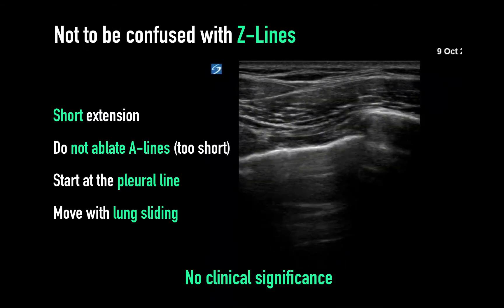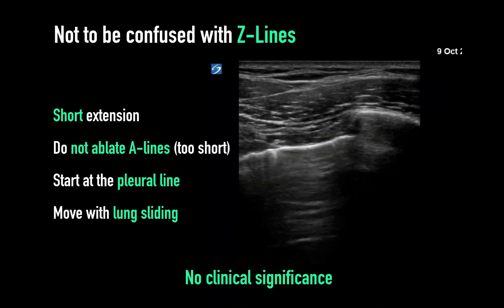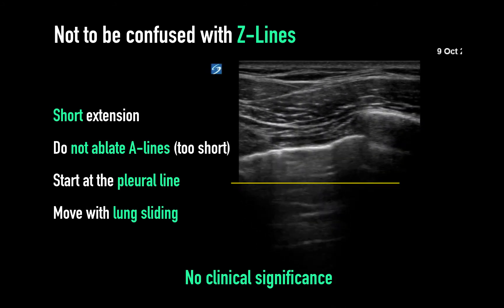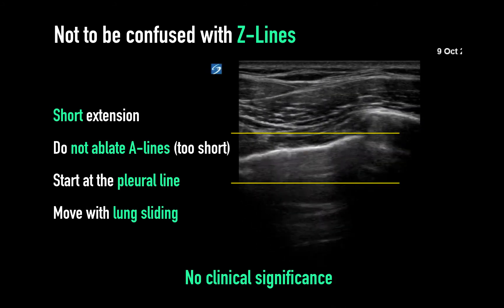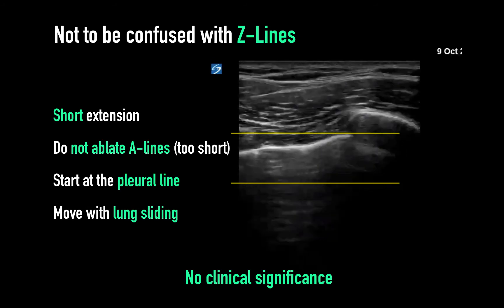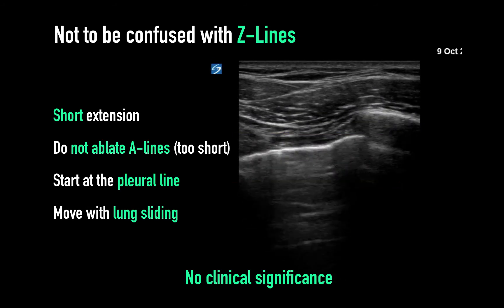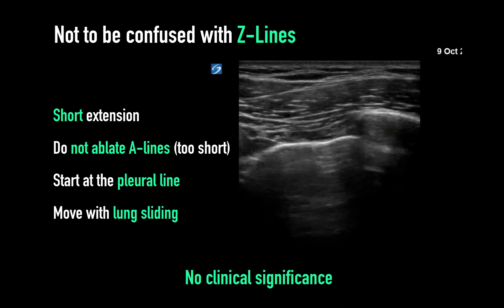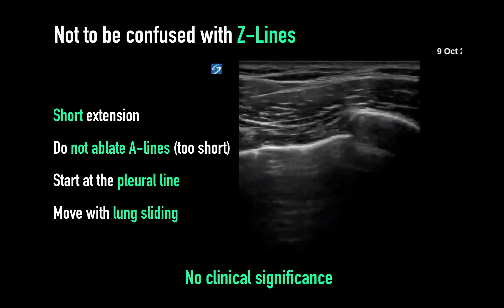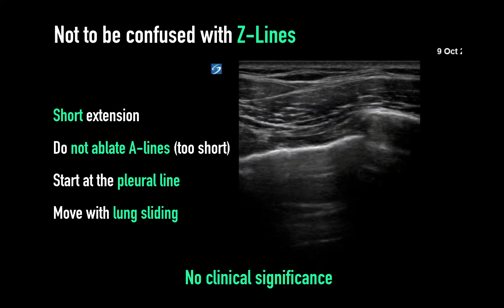There are other lines that can be confused with B-lines. These are called Z-lines. They are very short — they go from the pleural line but don't extend to the far field. They also don't ablate A-lines, but they do move with lung sliding. These lines are yet to be of determined significance at this point in time.